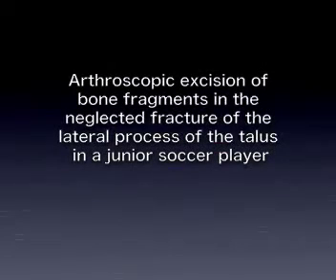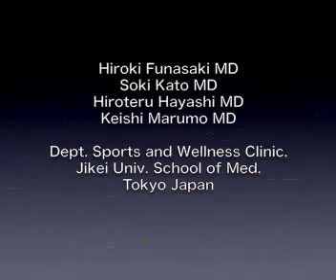This is a video of an arthroscopic excision of bone fragments developed after a neglected fracture of the lateral process of the talus in an 11-year-old soccer player. The fracture occurred during a soccer game 6 months before the procedure.